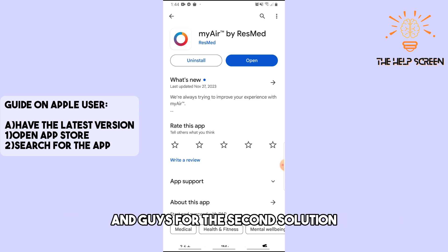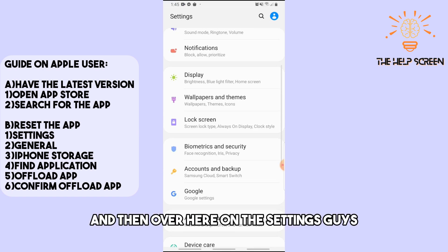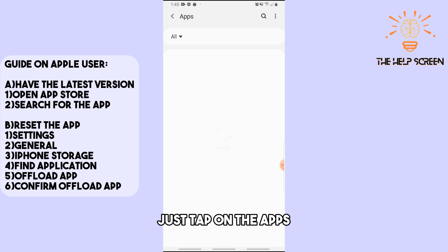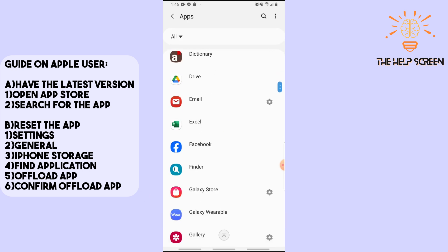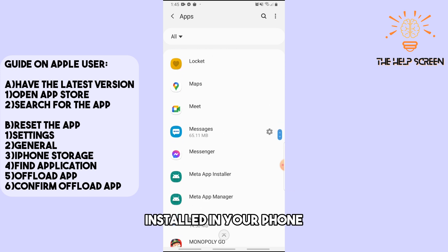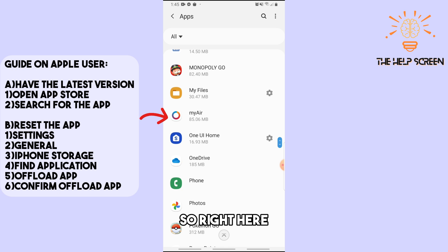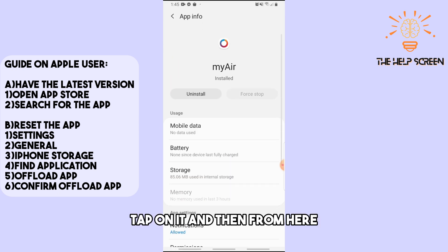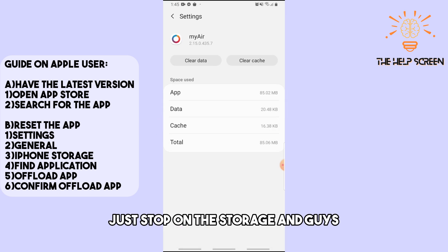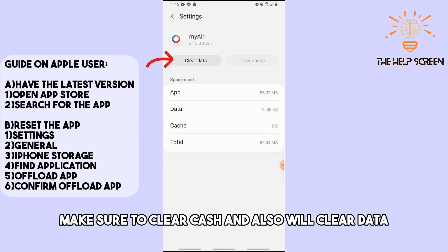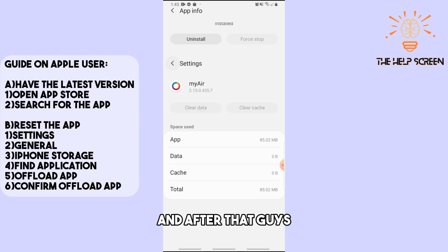For the second solution, go to Settings and tap on Apps. From there you will see all of the applications installed on your phone. Find the ResMed app, tap on it, then tap on Storage, and make sure to clear the cache and also clear the data.